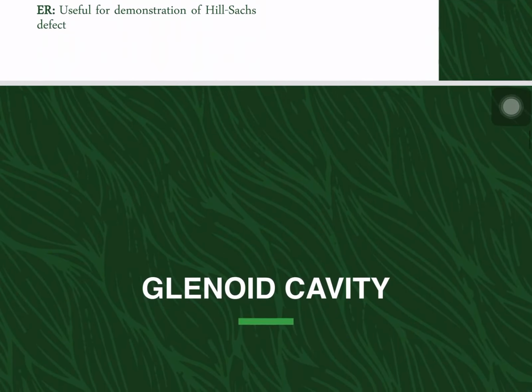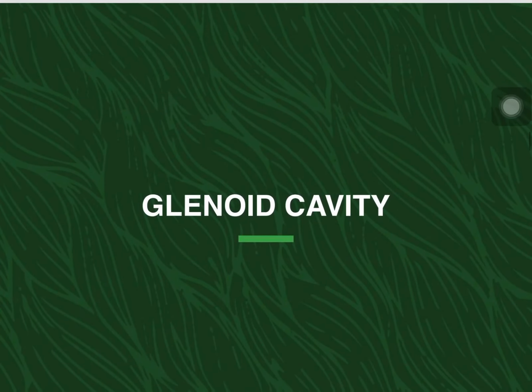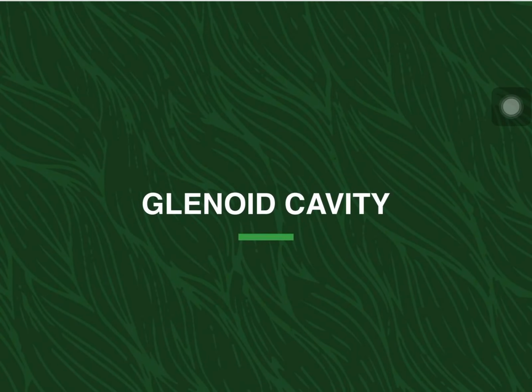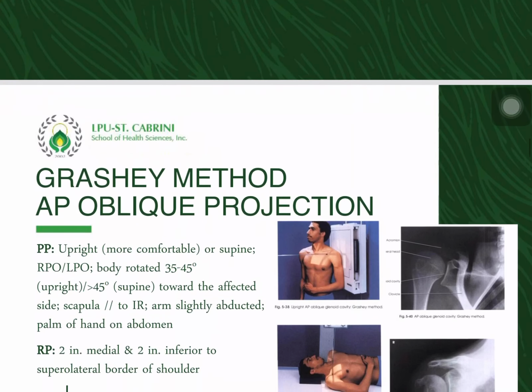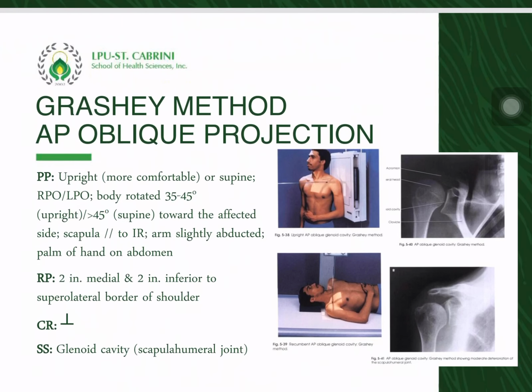Now let's proceed with the projections that will demonstrate the glenoid cavity. So glenoid cavity is a shallow oval depression at the lateral angle of the scapula where the humeral head articulates. So first we have the AP oblique projection, Grashey method.